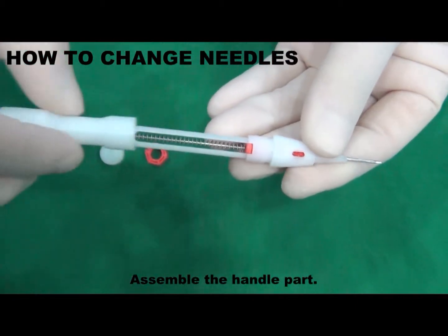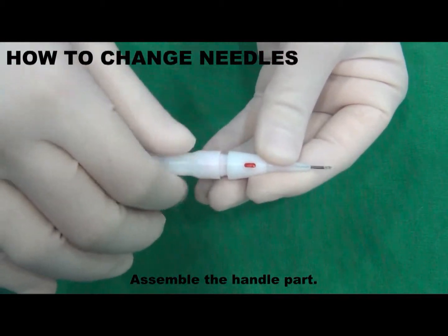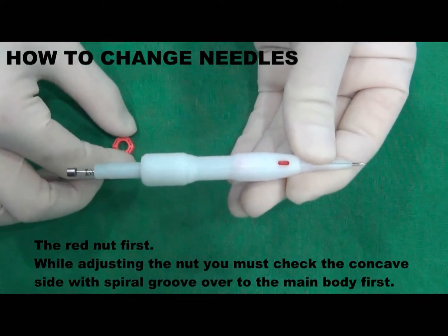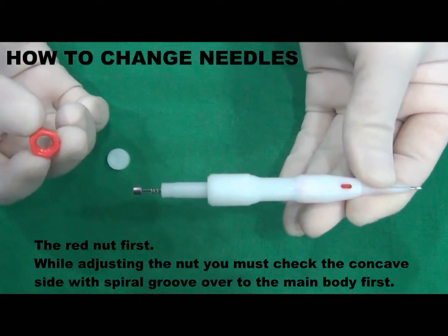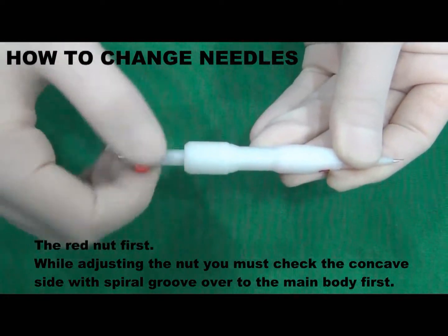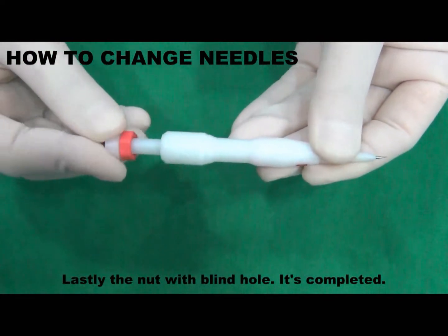Assemble the handle part. The red nut first. While adjusting the nut, you must check the concave side with spiral groove over to the main body first. Lastly, the nut with blind hole. It's completed.